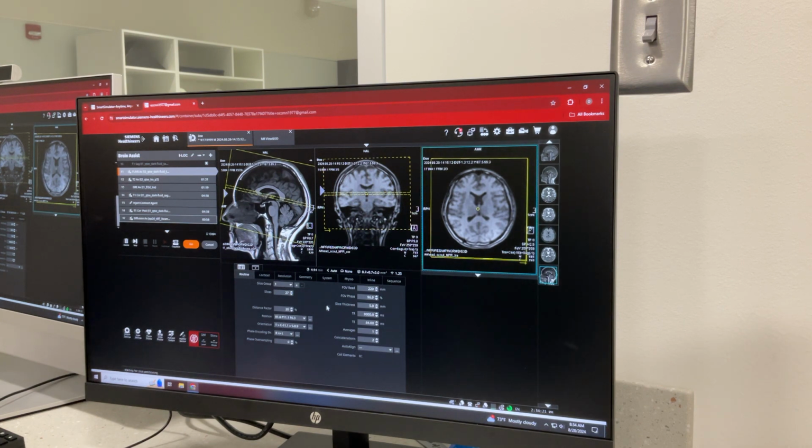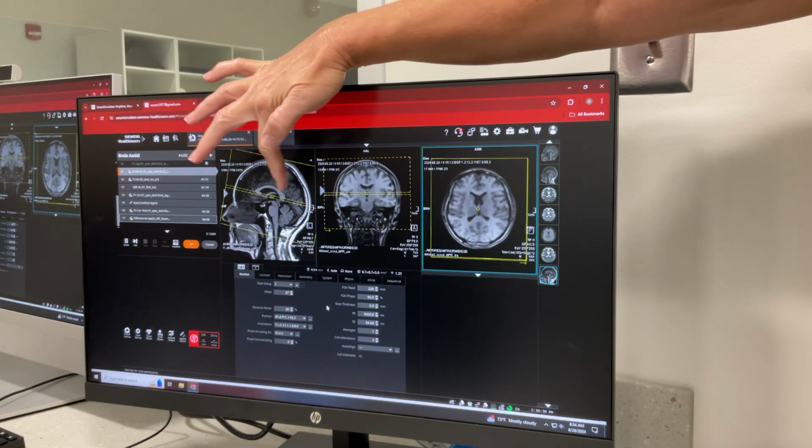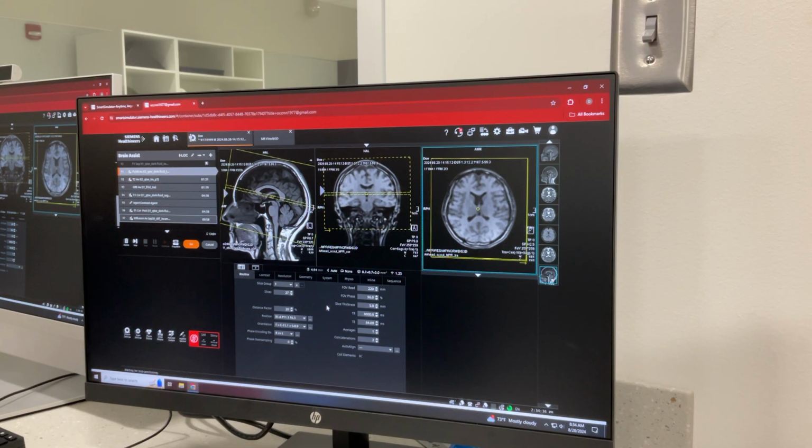And I like how you guys have angled with the corpus callosum here. When we're setting up axials or transverse, we're angling with the corpus callosum, the genu, the splenium, so we're going parallel with that. Good job. And she's still nice and centered. That brain is centered in her slices.